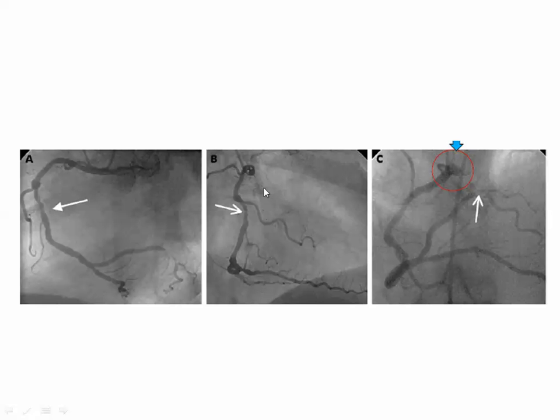RAO, it's as long axis, okay? Anterior, apex, inferior, okay? So, and this is perpendicular to the atrioventricular groove, okay, or sulcus. So this is RCA, okay? What do you expect this to be? This is RCA. What's this branch? This may be marginal, yes.